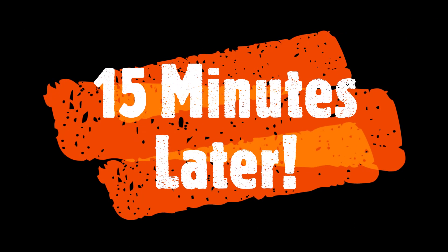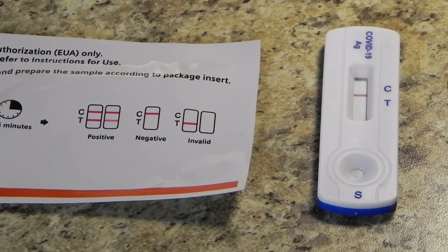After 15 minutes, it's time to read your test results. You don't want to read your results before the 15 minutes, but you also don't want to wait past 20 minutes. So there's about a five-minute window in which you really want to look at your test strip.